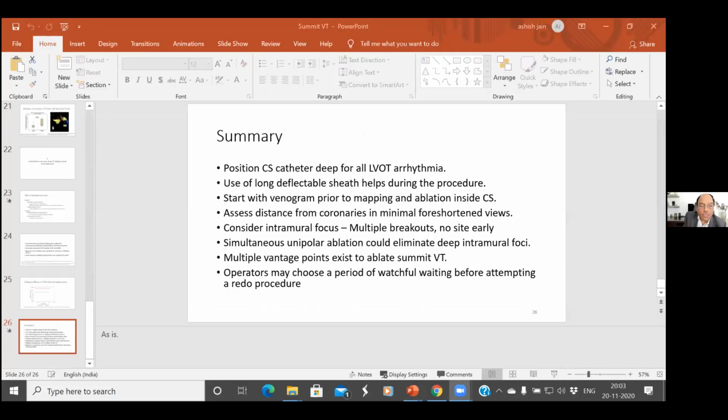Thank you, Dr. Shakti. That was an excellent presentation. I think power delivery within the GCV is a real problem, and there are a couple of things one can do. You can use ice cold saline instead of room temperature saline, which might allow increased delivery of power. And second, as you already mentioned, half normal saline, which will increase the virtual electrode and may create a bigger lesion.